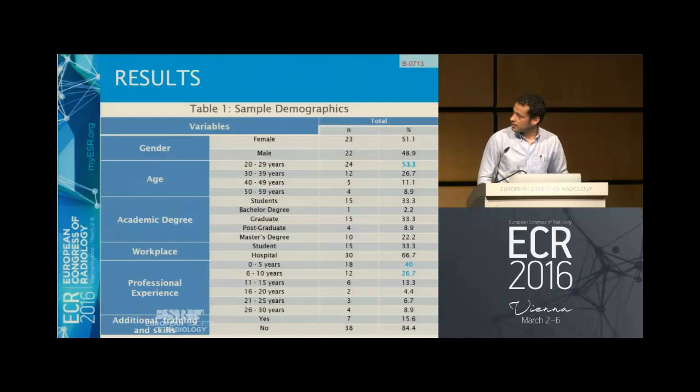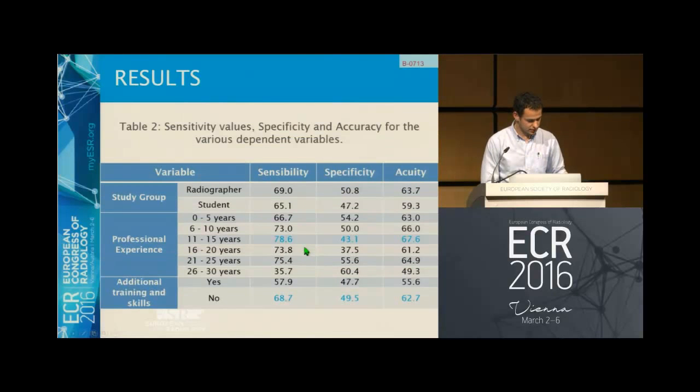This is a table with the sample demographics. I will just bring attention to the age of radiographers. We can see that they're quite young, and the majority between 0 and 10 years of experience. Here are the sensitivity values.